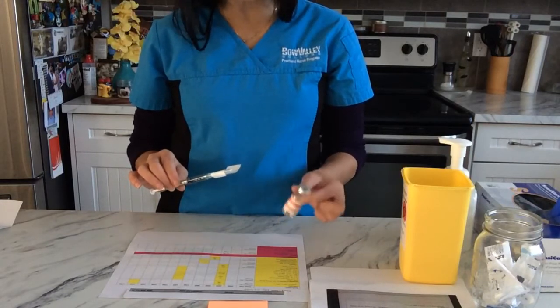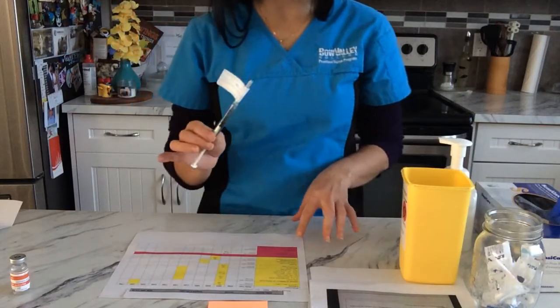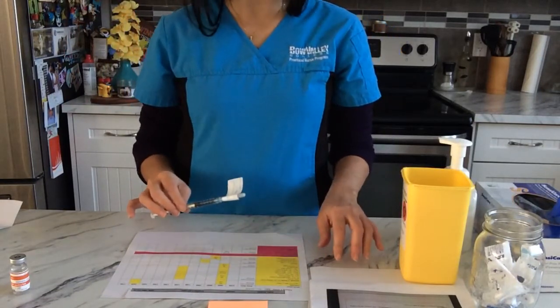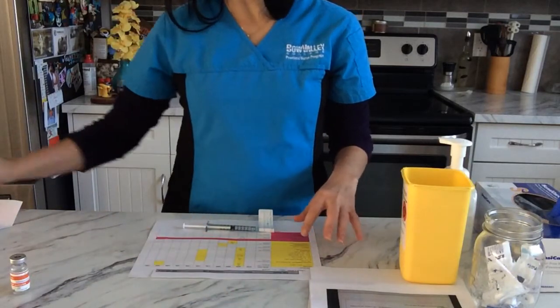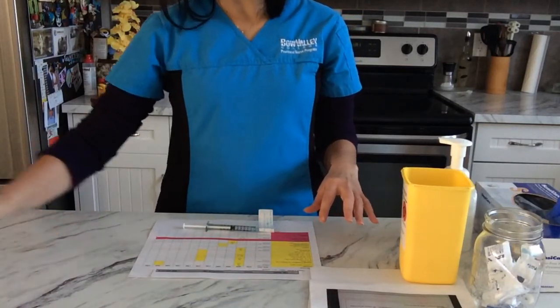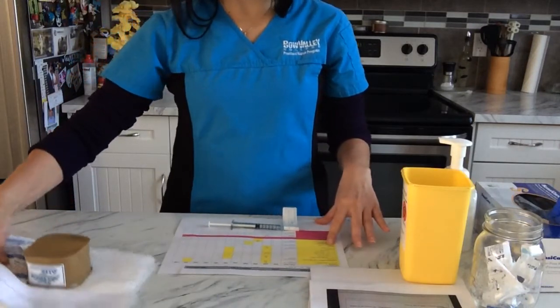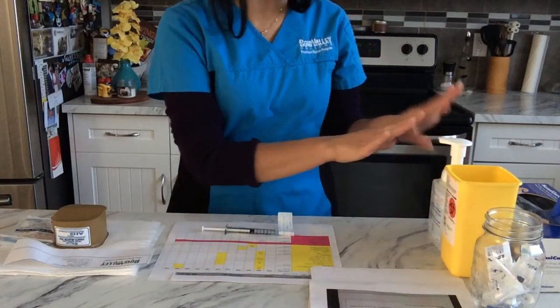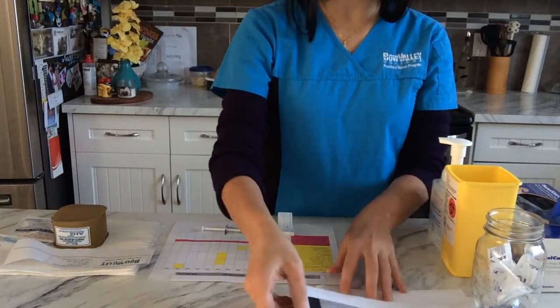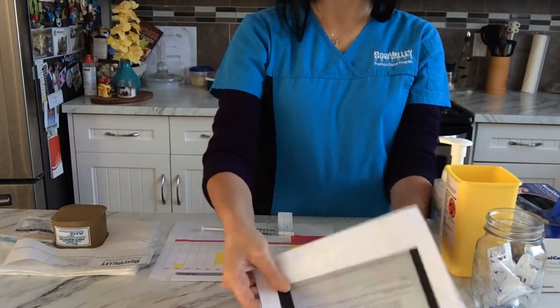So I'm gonna leave the vial, and I'm only going to bring my syringe and my MAR to the patient's room. Okay, I will remove this. I'm going to the patient's room. I'm gonna bring my hand container, my hand sanitizer. I also have a pitcher.